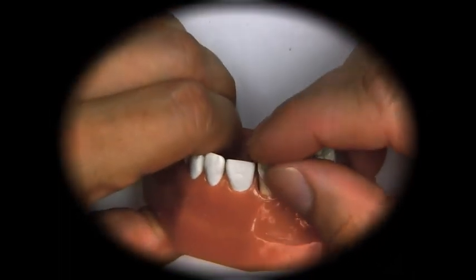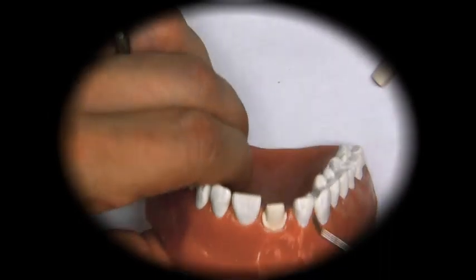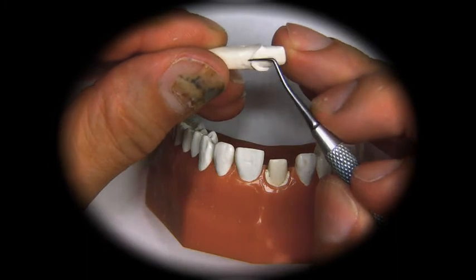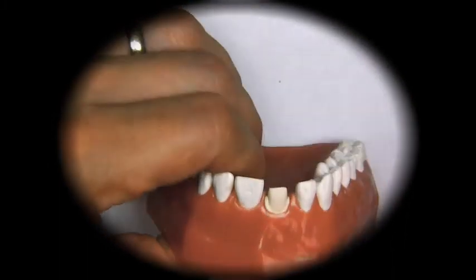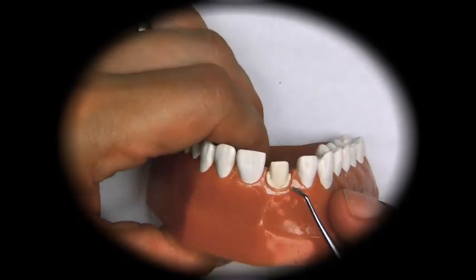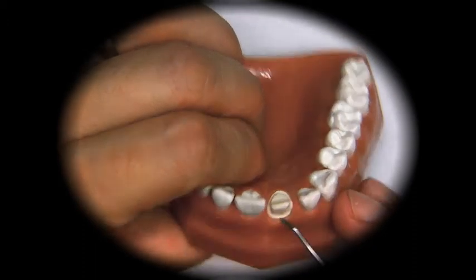When we put it back here, we have to make sure that the margins, these are the margins right here, are below the margins of the model. You see how our margins are on the bottom.